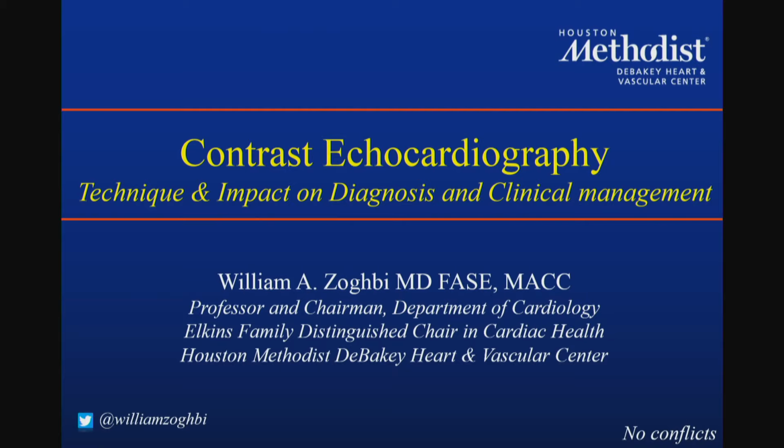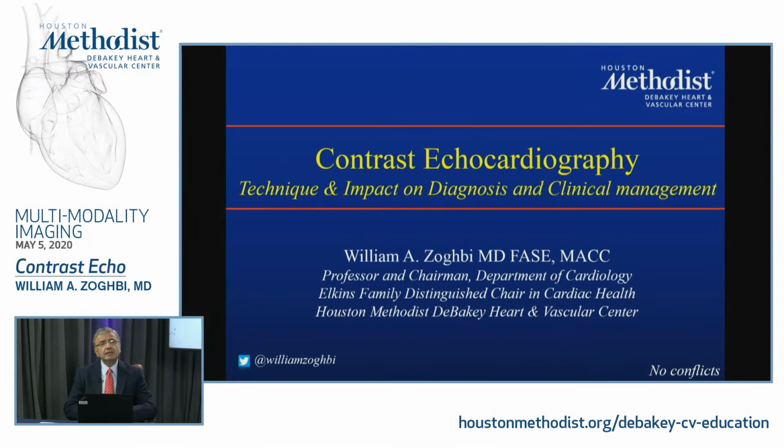Contrast echo is unique, I think, whenever we talk about contrast in any imaging modality, because in echocardiography, as many of you know, the generation and enhancement of the image is predicated not only on the imaging agent that we use, but also on the settings of the ultrasound machine. At times, if the wrong settings are put together, you may actually destroy the image and may not have the most pleasant image to make your diagnosis or get any information that you may want from the contrast echocardiogram.